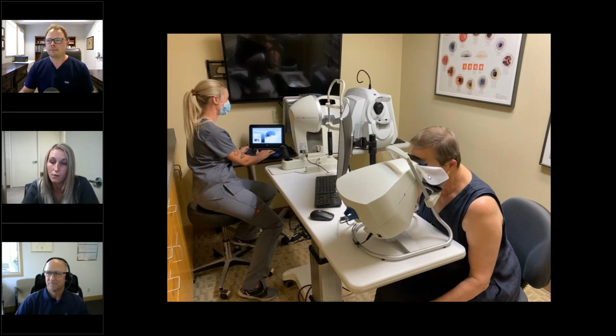Of course, if they were younger, yeah, I could get an OCT done fairly quickly, but not if they were an elderly patient and there was cataracts and other issues involved. It's hard to see sometimes with the OCT. And 4 pictures per eye as well. Dr. Hill, you like to have your pictures. Yeah, I do. We're doing optic nerve scans, radials, and macular cubes so that we can get the ganglion cell layer and everything. So OCT does take a little while.